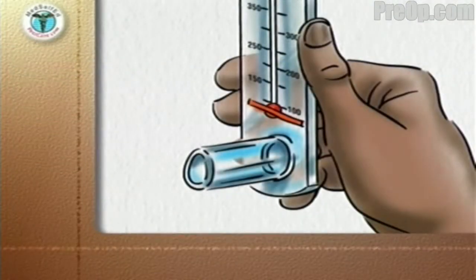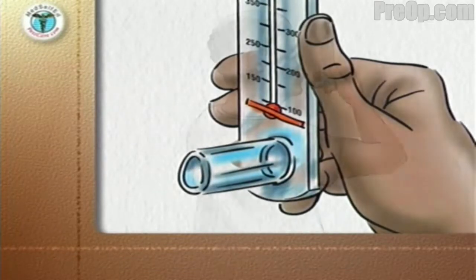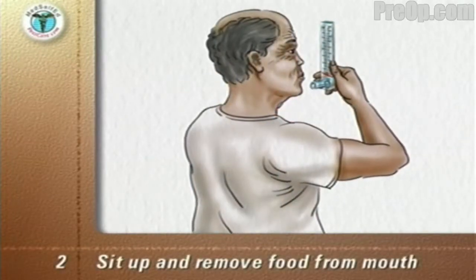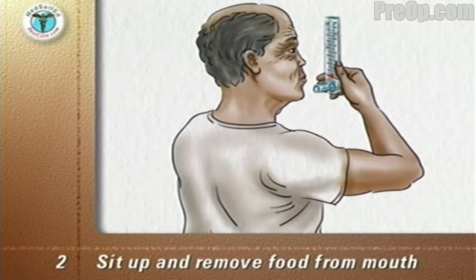To use your peak flow meter, first make sure the marker on the meter scale is at zero. Preferably stand or sit up straight. Remove any gum or food from your mouth. Hold the peak flow meter horizontal with your fingers away from the scale.